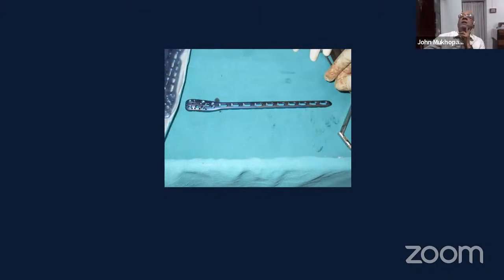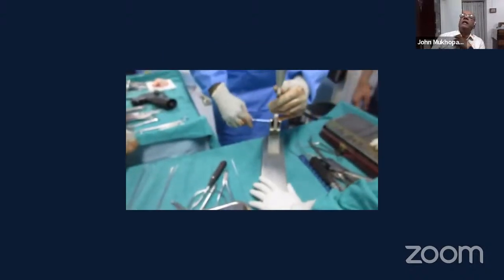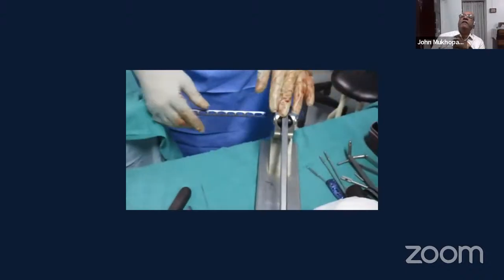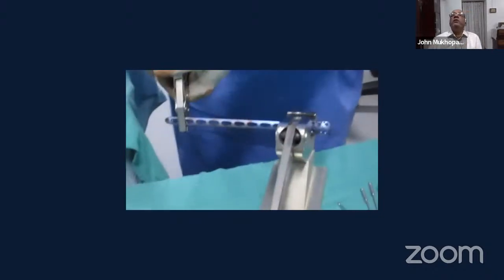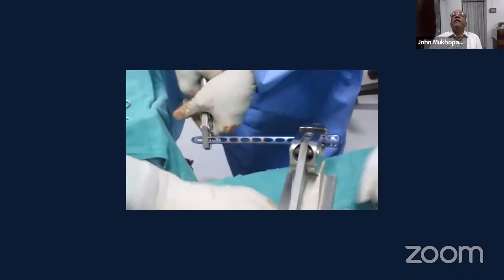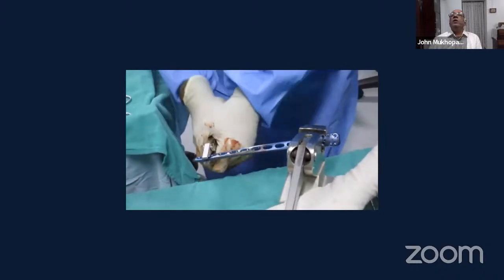The way we do it is hold the proximal part of the plate in a plate bender clamp. You can see how this clamp is used to hold the proximal part of the plate tight. Then with a pair of strong pliers, you go to the end of the plate and gradually twist the plate while you're holding this. So this should not move. You twist the plate using some force, which takes some strength, but hold it carefully and make sure that it's not moving. And you can see how the plate is being twisted into a spiral.